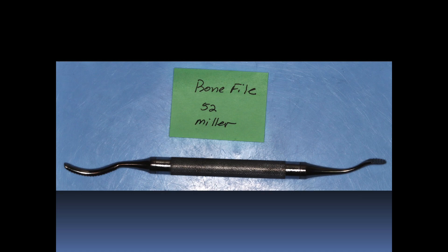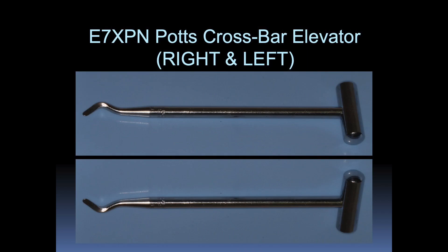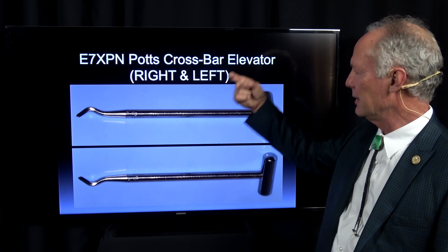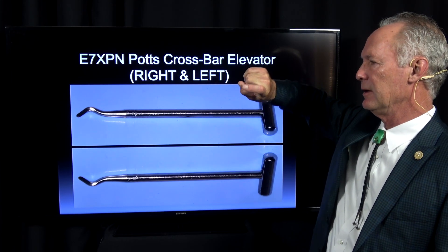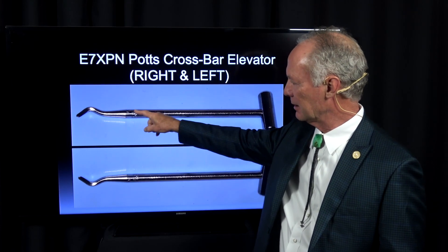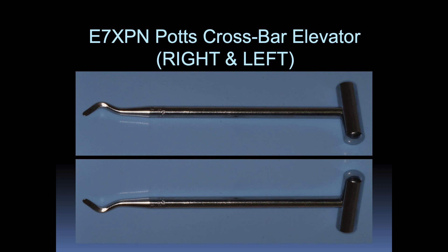This is a bone file — it's a large bone file for smoothing the bone after you've extracted a tooth. These are crossbar elevators; there's one this way and one this way. If you're extracting an upper right third molar, you want this one. If you're extracting an upper left third molar, you want that one.